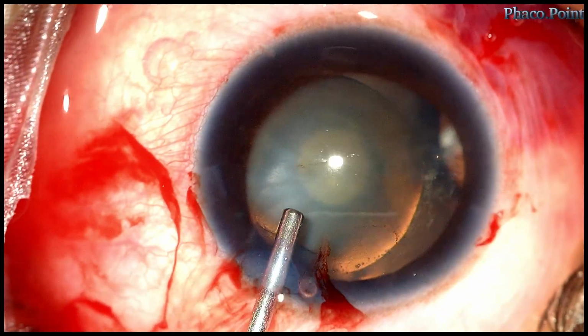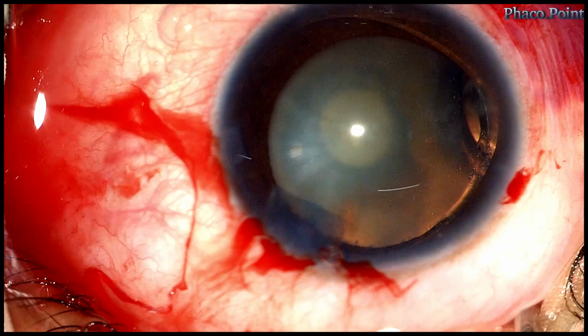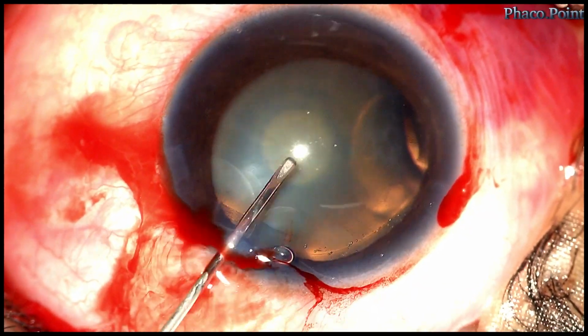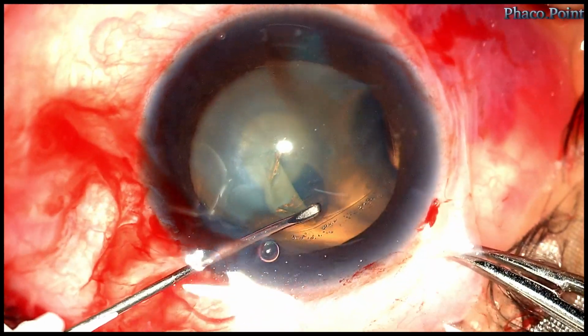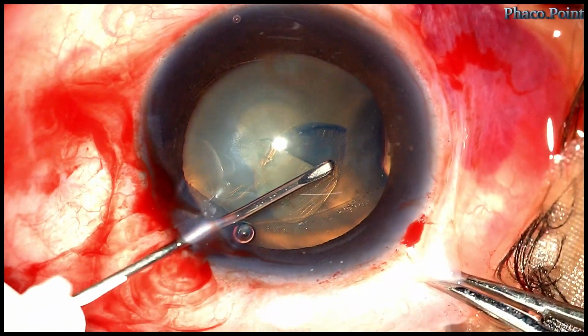I now proceed with the capsular rhexis. I've just injected a dispersive viscoelastic to keep the vitreous away. And as in any case of zonular dialysis, I decide which is the center of the nucleus. I start from an area away from the zonular dialysis and finally get to the area of the zonular dialysis.